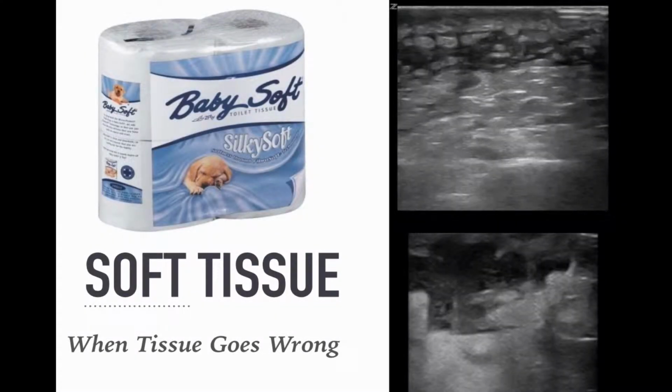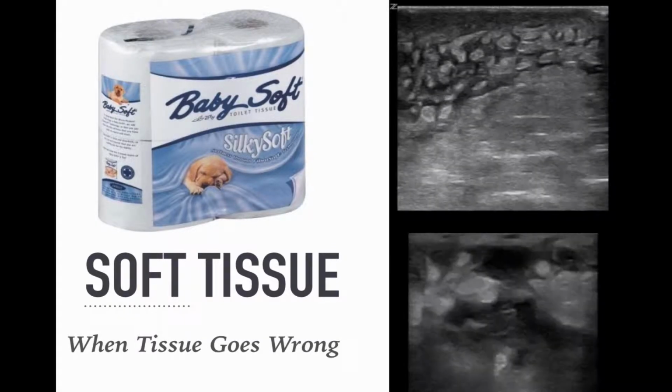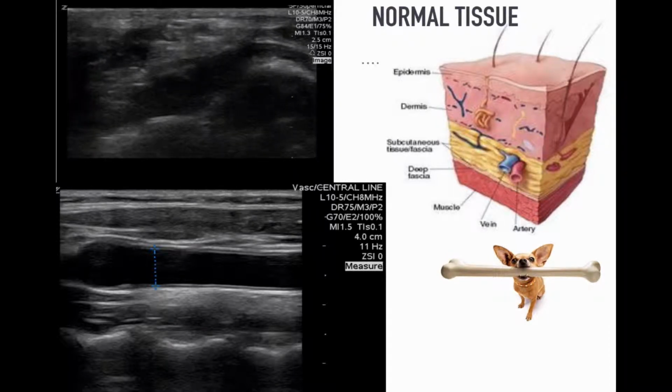So let's start with our soft tissue first. When tissue goes wrong, let's jump right in. So first, let's look at normal tissue. You want to look at normal before you look at abnormal.